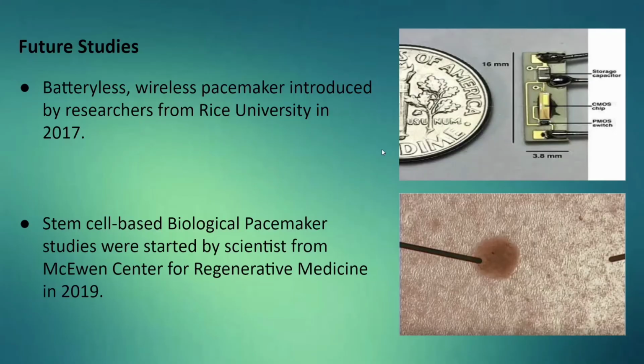Now let's continue with the future studies of pacemakers. A batteryless wireless pacemaker was introduced by researchers. The device harvests energy wirelessly from radio frequency radiation transmitted by an external battery pack. The wireless power transmitter is a few centimeters away. The device has been successfully tested in a pig, but unfortunately there is no documentation of use on the human body.